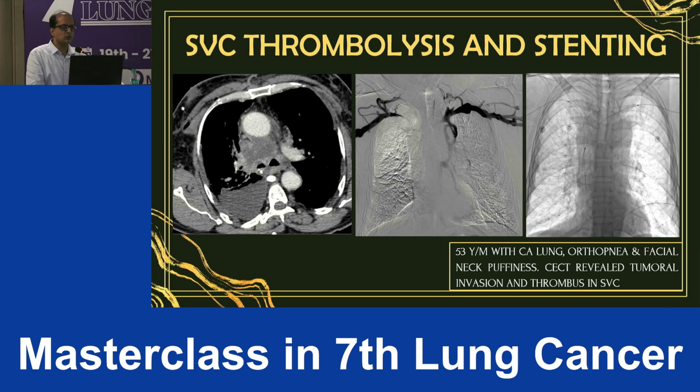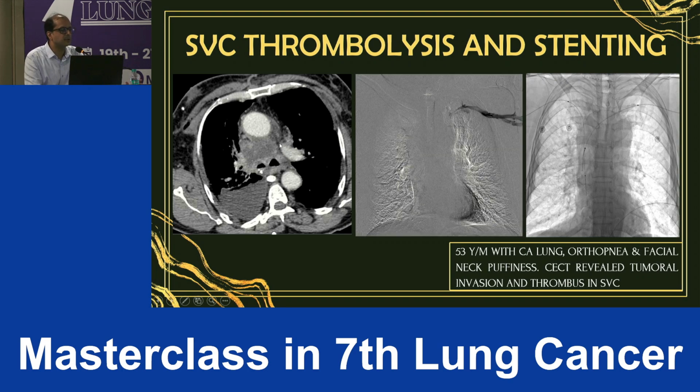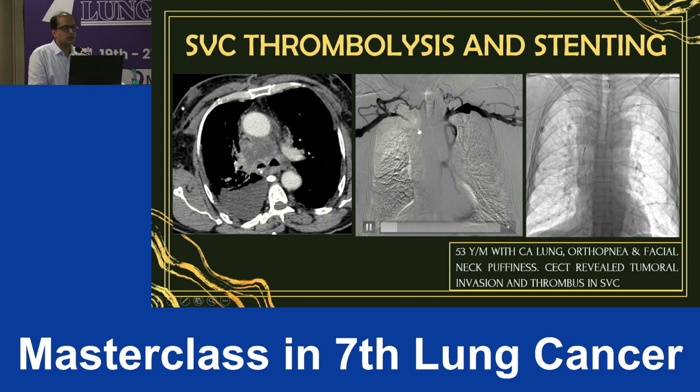And coming on to some of the other features, when the patient is having CA lung with orthopnea, facial puffiness, and facial swelling, there is an invasion into the SVC. That is when SVC thrombolysis can be carried out. So this is what we see here.